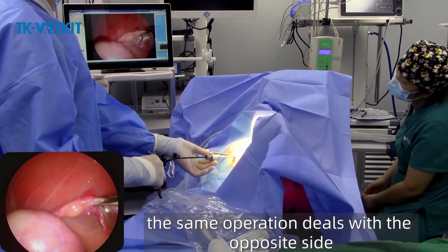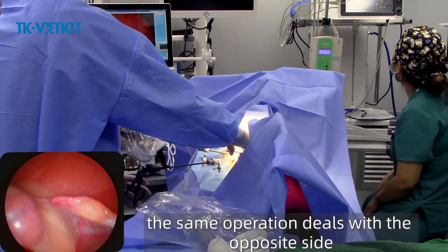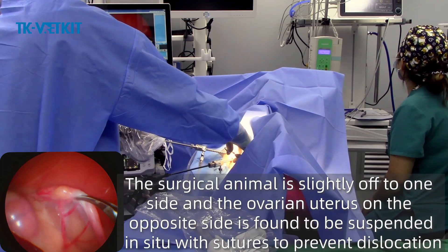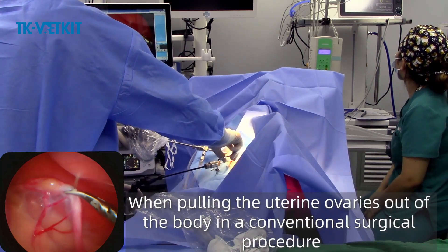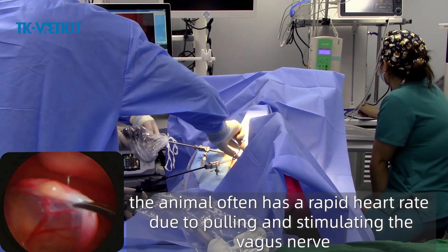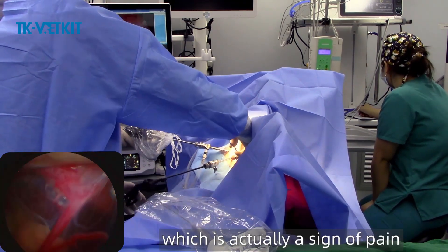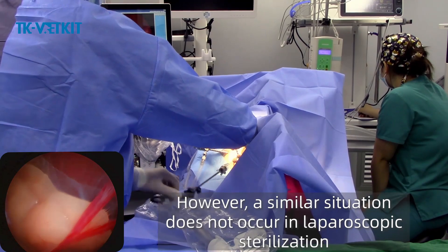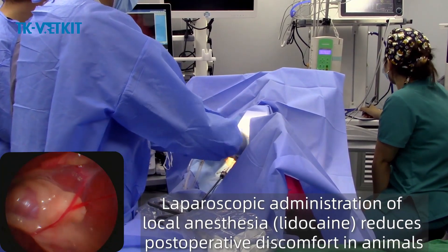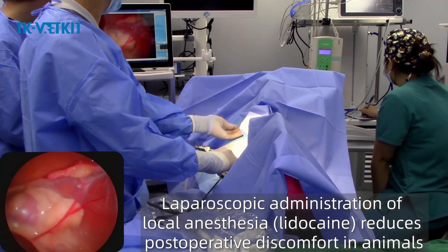The surgical animal is slightly tilted to one side and the ovarian uterus on the opposite side is found and suspended in situ with sutures to prevent dislocation. The same operation is performed on the opposite side. In conventional surgery, pulling the uterine ovaries out of the body often causes a rapid heart rate due to stimulation of the vagus nerve, which is actually a sign of pain. However, a similar situation does not occur in laparoscopic sterilization. Laparoscopic administration of local anesthesia reduces postoperative discomfort in animals.